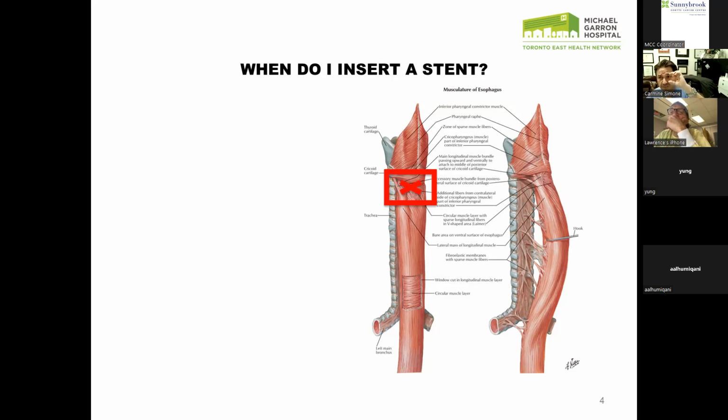And so for the proximal deployment to be very close to the cricopharyngeus, and that is even the upper constrictor, so not even the lower, but anywhere around the retropharynx within 2 centimeters, that's really a no-fly zone. Sometimes we're close to it, and what we'll do is monitor patients in the recovery room. If they open and start to retch, we just bring them right back and take it out, because we know that that's not going to improve.